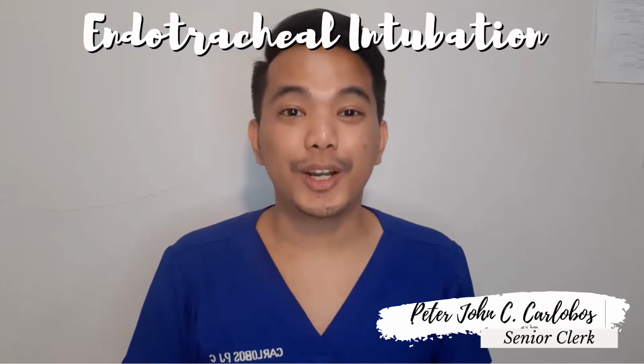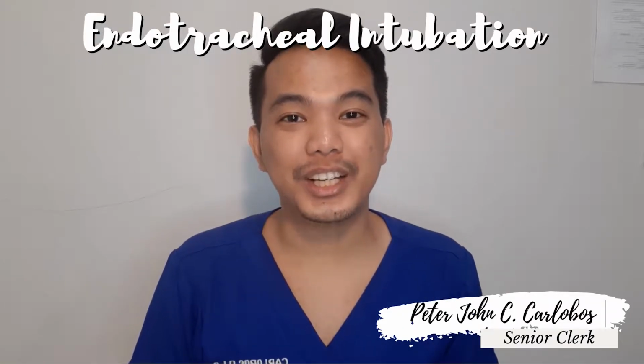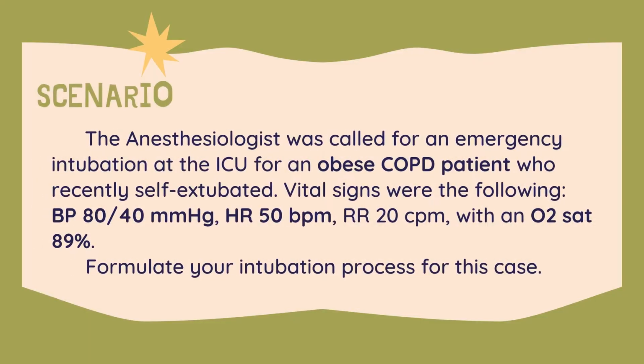Hi, I'm Peter Carlobos and I will be showing you how to perform endotracheal intubation. We have the following scenario.